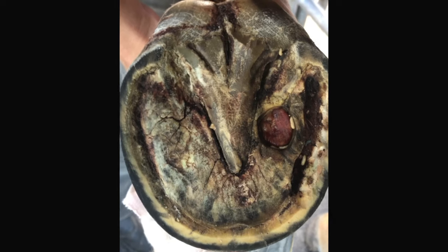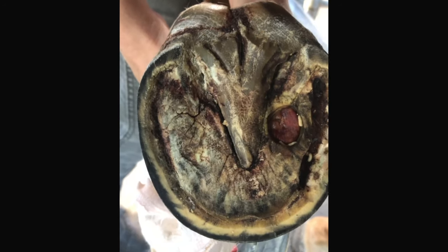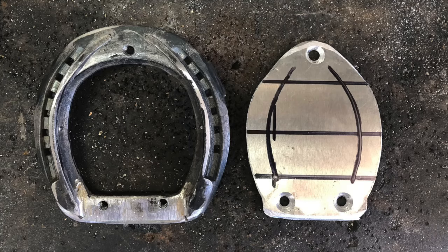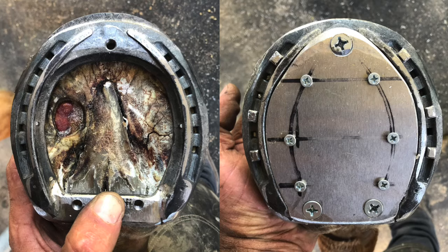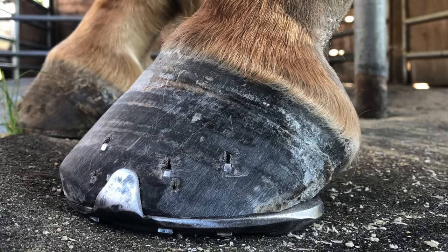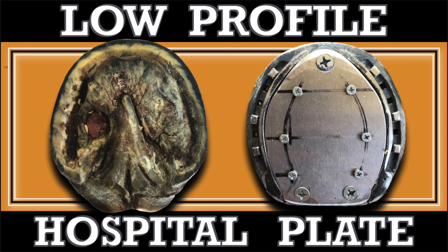Medical grade maggots had effectively finished debriding the infection in this horse's foot. It was now time to fit a hospital plate. Although I had made many traditional hospital plates in the past, this was my first time crafting a low profile version. The equine hospital that I work with requested it to aid a horse so it could resume its rehab for a hind leg injury. I thoroughly enjoyed working on this case, so let's dive into building this low profile hospital plate shoe.